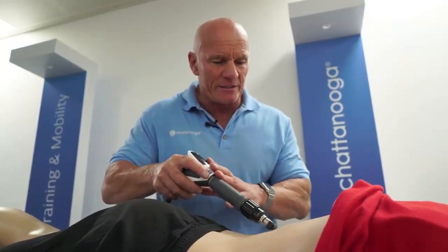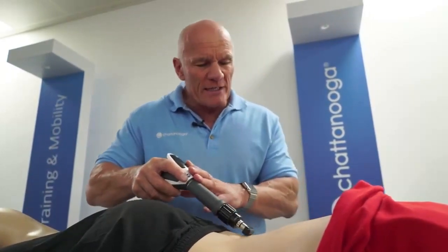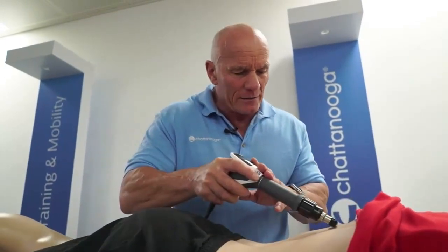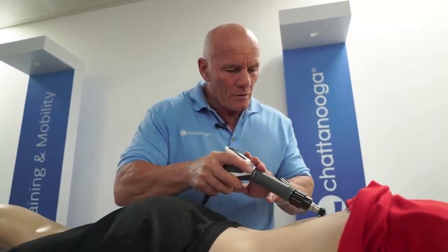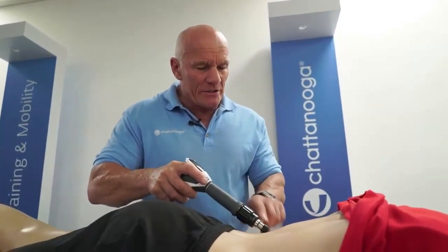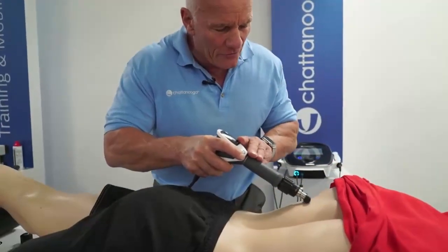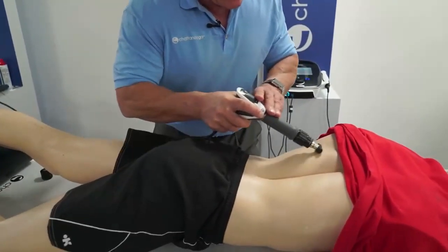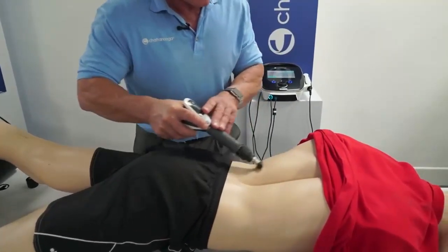So we'll do 3 to 5 tracks up and down here. We might move to the next level here and do 3 to 5 tracks along there, but suddenly we're going to find it gives, and it moves nice and slowly.